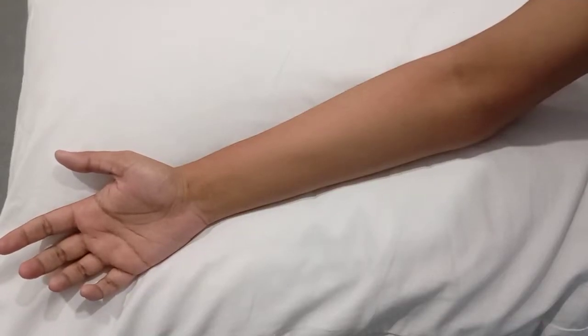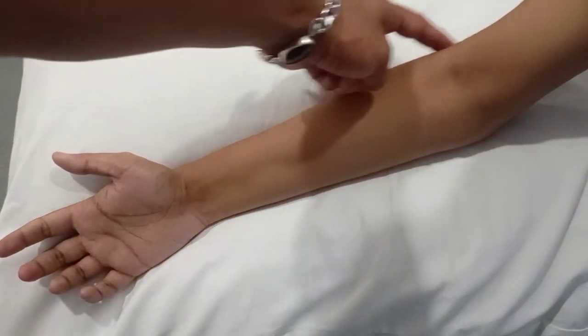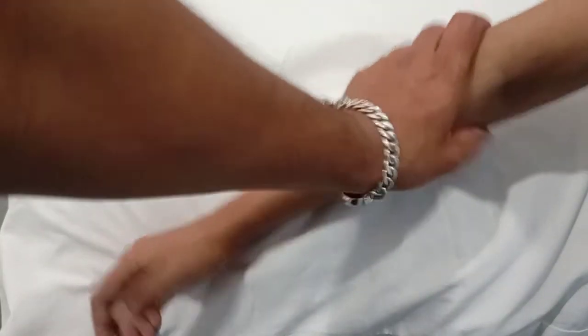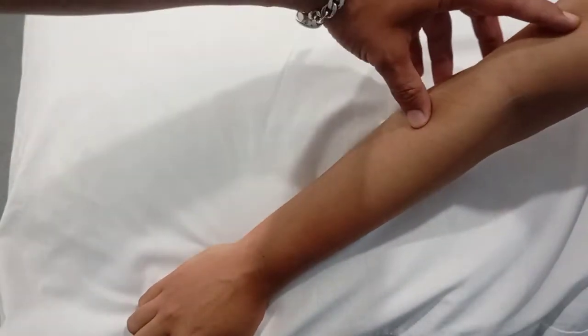Bismillahirrahmanirrahim. Today we will be discussing how to apply TENS for pain relief in Tennis Elbow, which is also called lateral epicondylitis. The region of pain is along the lateral border of the forearm, and here we can apply TENS using two electrodes.